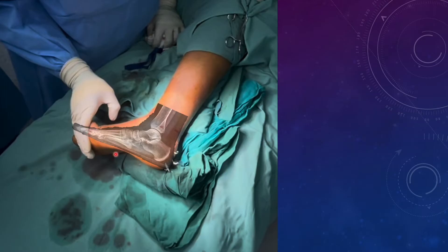Definitely, for getting this kind of view, we want the C-arm console directly above the ankle. What about the axial view?